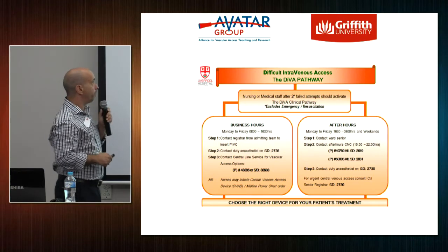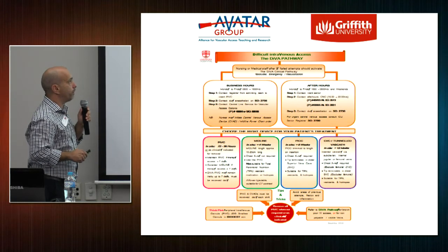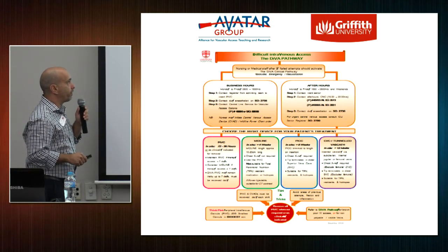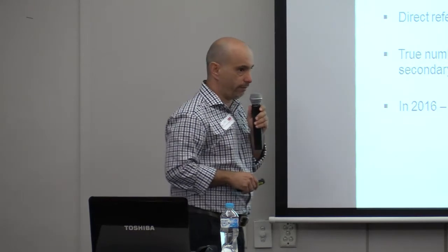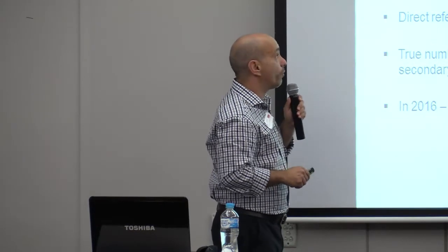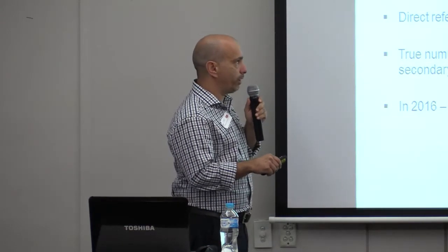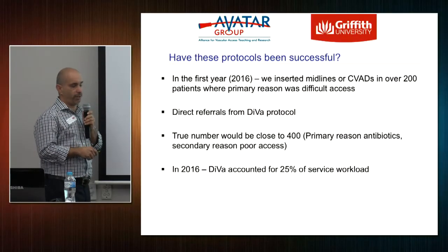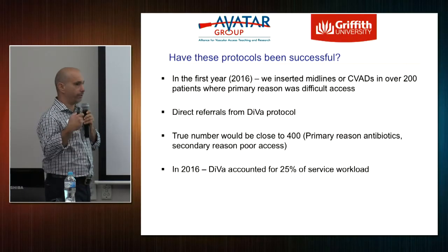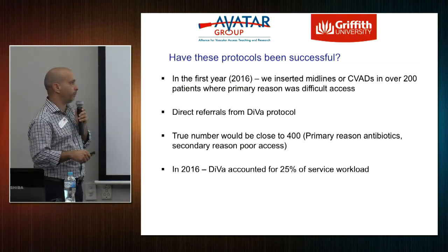So in the 12 months that it was running, in 2016, we inserted over 200 midlines and CVADs for the primary reason of difficult access, and they were direct referrals from the DIVA protocol. They were ones where the staff reviewed the patient and said, you know what, no, they've got difficult access. Let's just ring straight through and see if the central line service can put in something more secure.